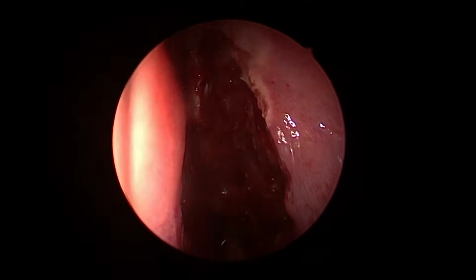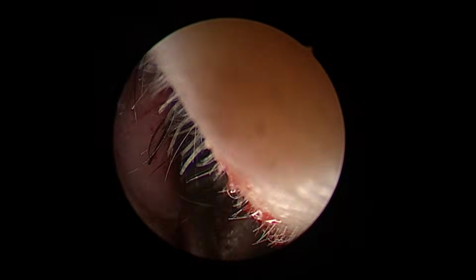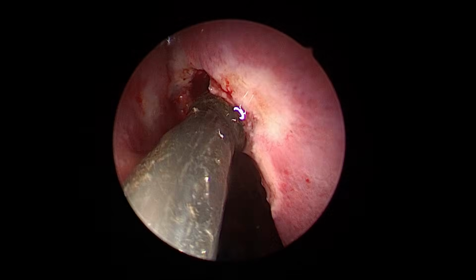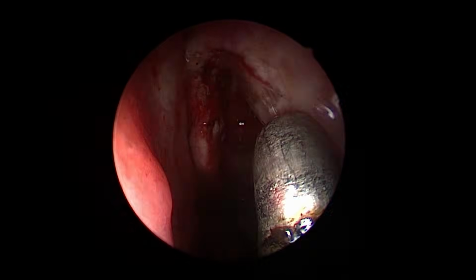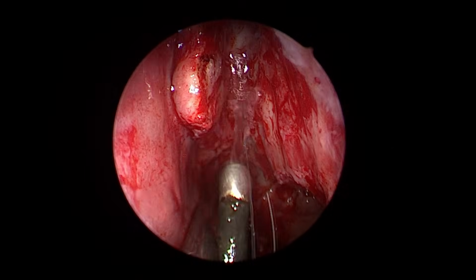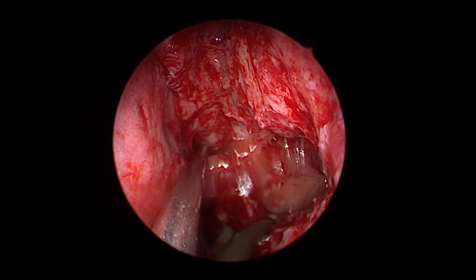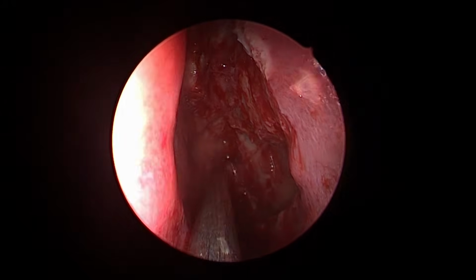See now, I brought this because there is a mixed crowd, there are young PGs, so I think the landmarks, where it is, are to be known. So now I can irrigate for a while. This irrigation is key for the remaining mucosal ooze. It can wash away all inflammatory material from the sinuses.